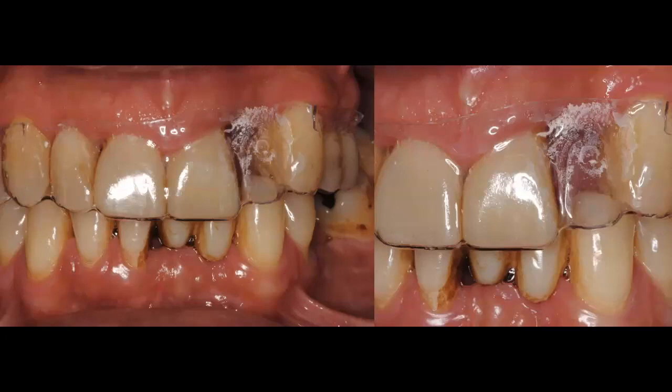But this guide, this clear matrix, and even today that I use a lot of 3D printed guides, and I'll show you a case at the end on how I do that today. This is still a valuable tool for me because I can still use this even if I'm using a 3D printed guide. I can use this to see, okay, what would the crown look like once my implant is in that site? What would that restoration look like in this site with that implant in that location? So this is going to give you again that buccal lingual aspect of the actual tooth that would need to be replaced based out of your wax up, and that's what I'm doing here.